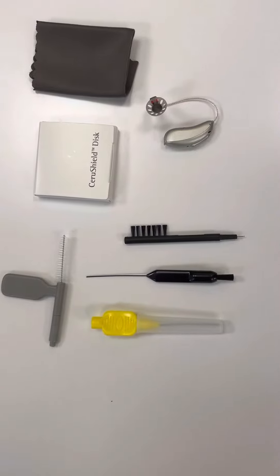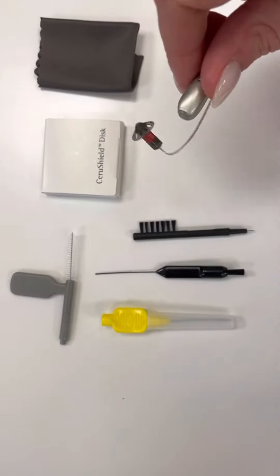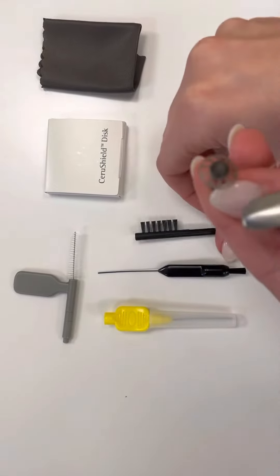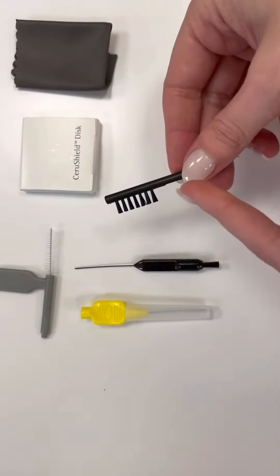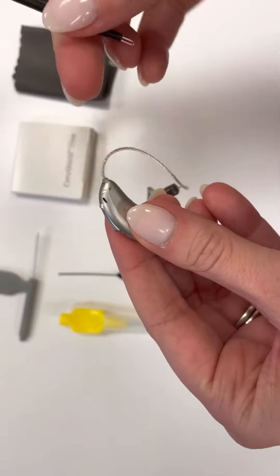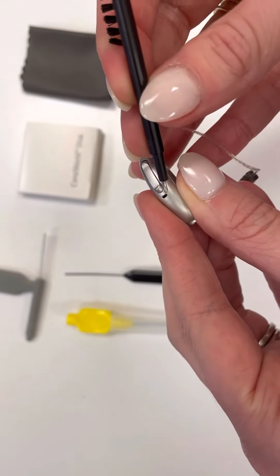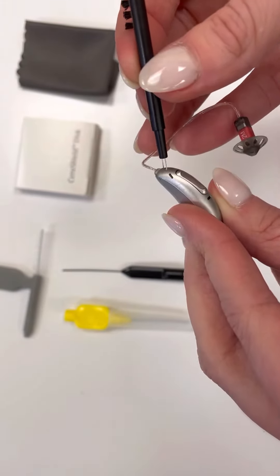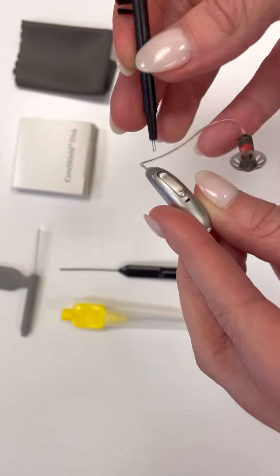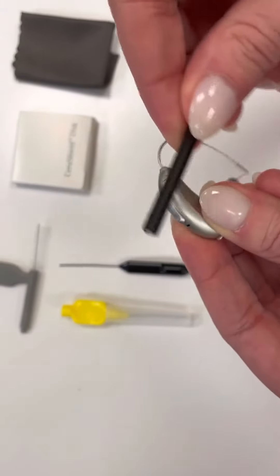Here's how you clean your hearing aid. This style is the receiver in the canal style of hearing aid. First thing we're going to do is take a brush. You could use any different type of brush, whatever came with your hearing aid, and you want to clean the microphone. The microphone is here, here, and here. Every hearing aid is different, but the microphone on this style is on the part that goes behind the ear.